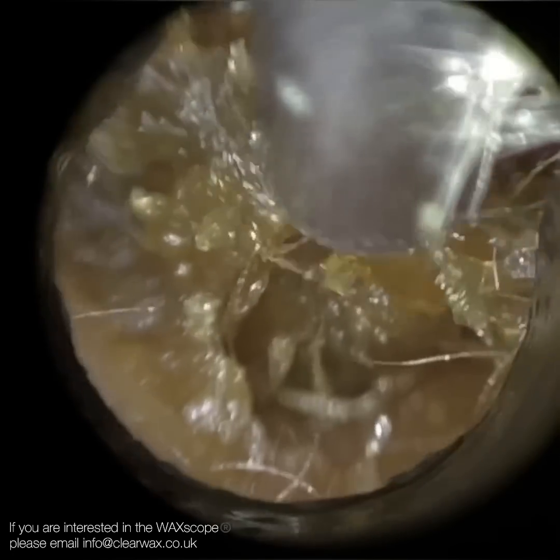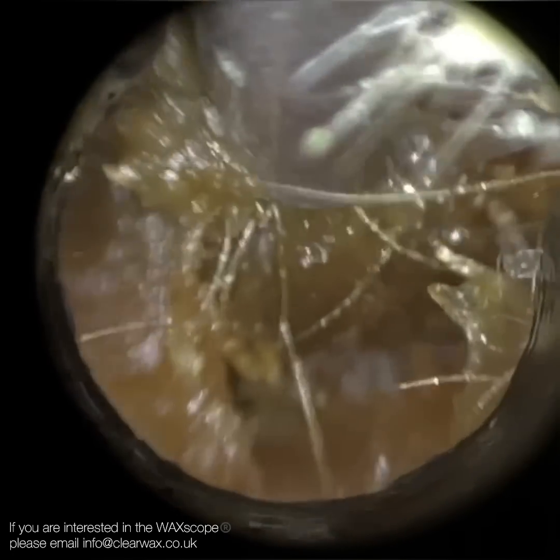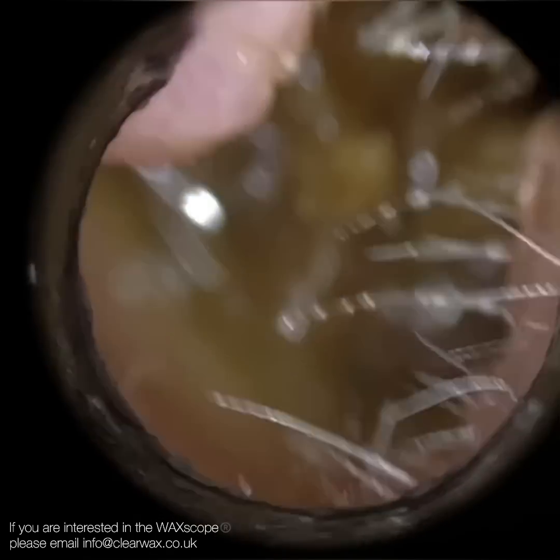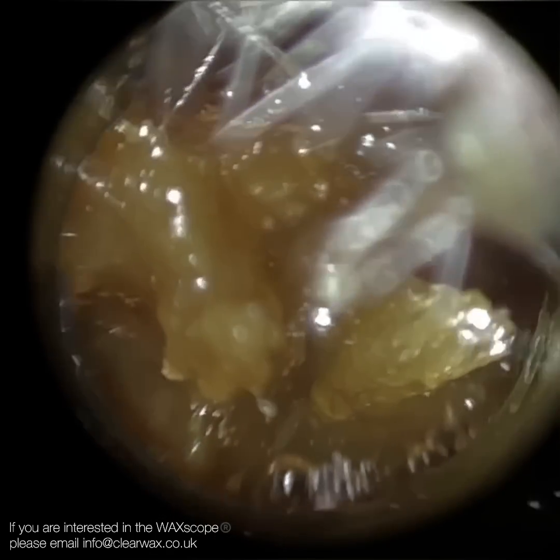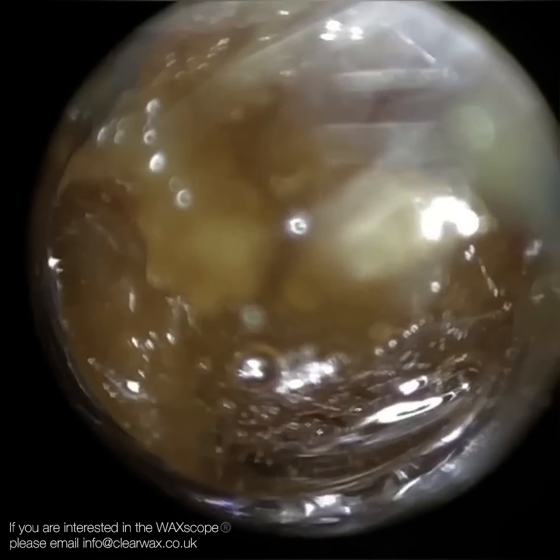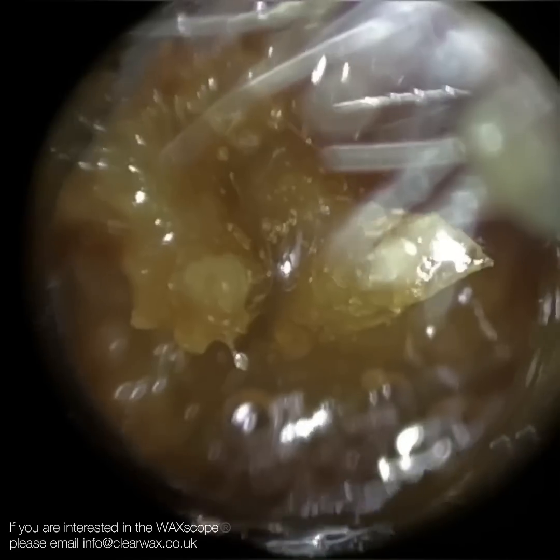A bit of backstory — this patient suffers from chronic wax impaction. They travelled a distance to visit me, and their previous experience elsewhere was extremely uncomfortable to the point where they had to ask the specialist to stop the procedure. So we had to bear that in mind.